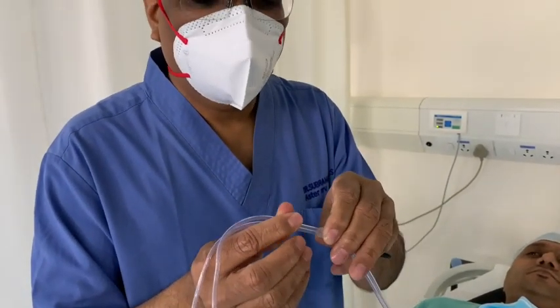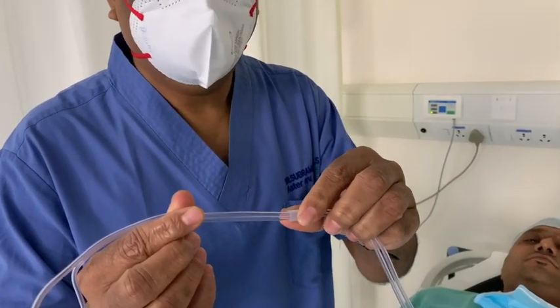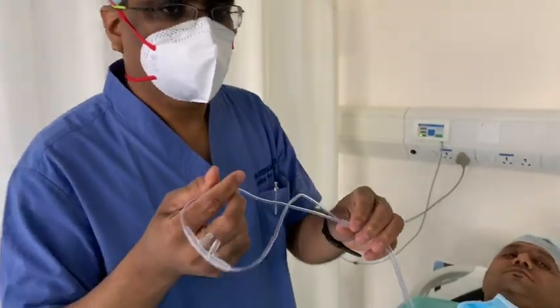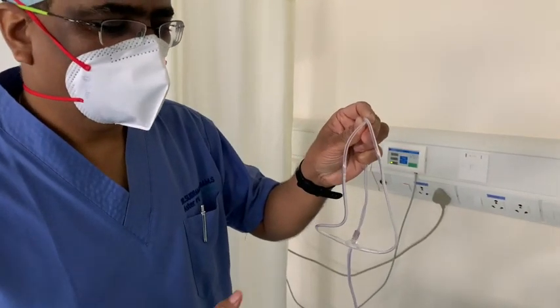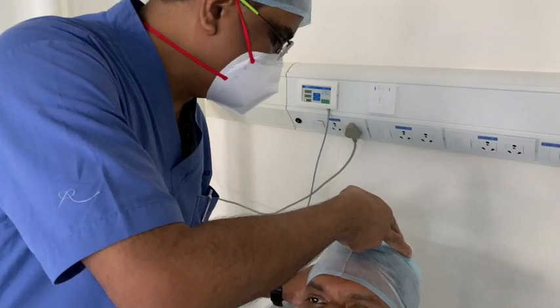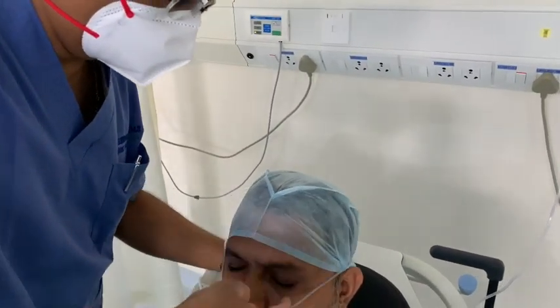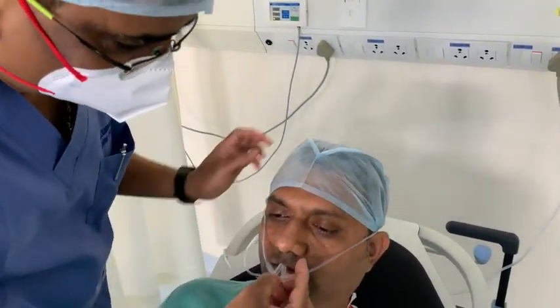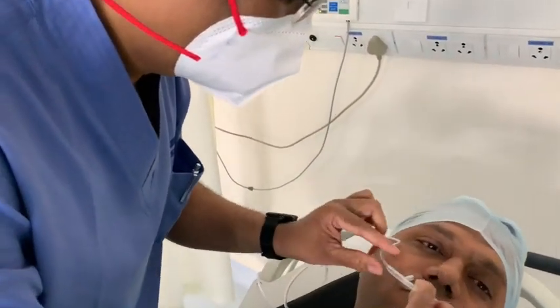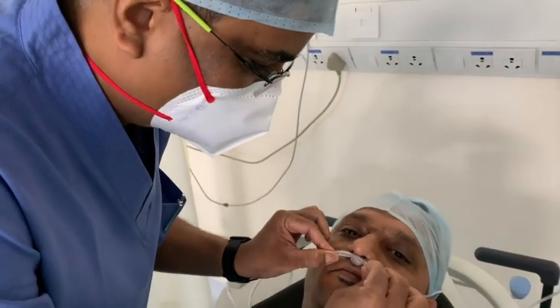There is an adjustment strap here which you can adjust to fit it exactly to the face. When we need to use it, we make sure that this goes behind the head, and then put this above the ears and gently insert it into each nostril.